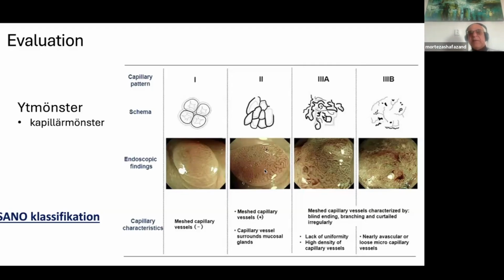It helps you. And I think you mentioned that as well: when you see the picture, that's why the recommendations for how to take a photo are the way they are, because they want you to make sure that you have seen the whole entire lesion from a distance, because then it can wake up something for you, that blink. Sorry. This is ugly. This is not a regular one.